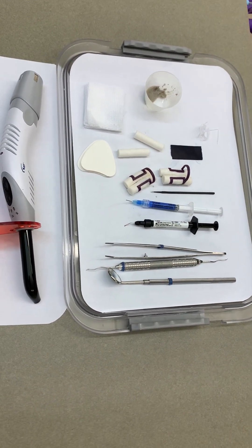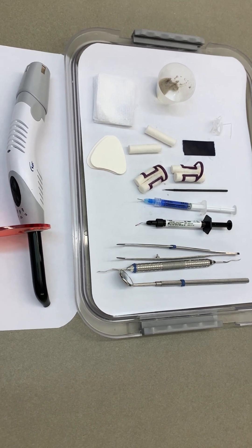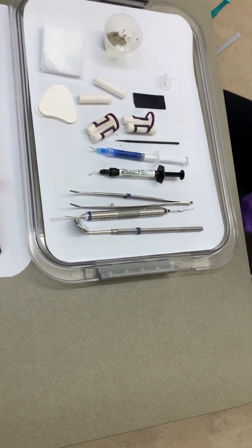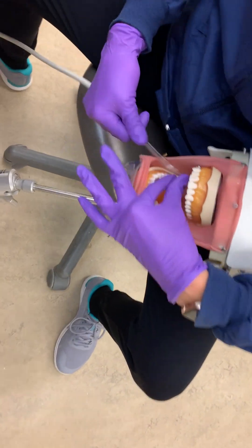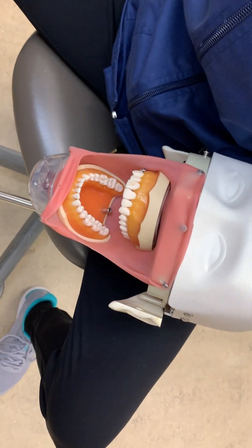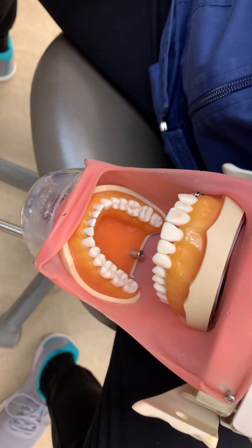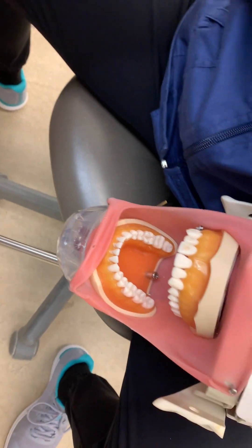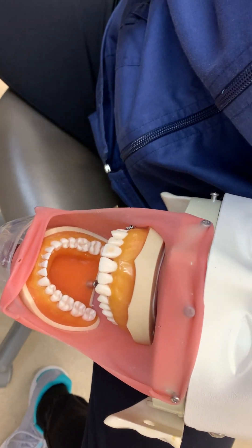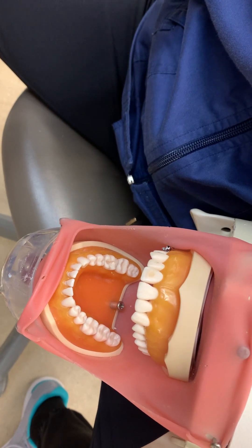Welcome to our video today on applying pit and fissure sealants. The first thing we're going to do is assess the need for pit and fissure sealants as directed by the dentist if required. Then we're going to explain the benefits of the sealant, describe the procedure if necessary, and obtain the consent of the client.